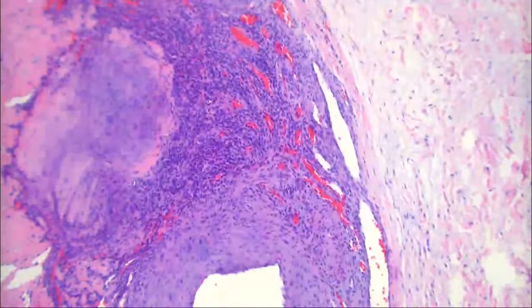So how do you finally call it? Myofibroma. So you wouldn't call this hemangiopericytoma? You can say there's also a pericytoma-like component at the periphery, but basically it's myofibroma. Sometimes people say myofibroma/myopericytoma, but I think this is a gorgeous example of it.